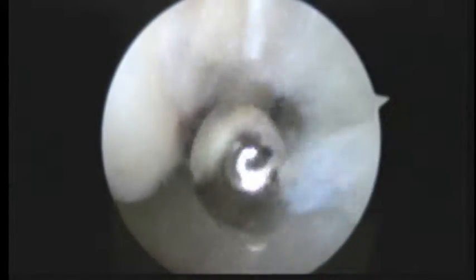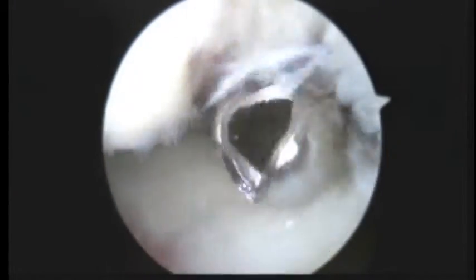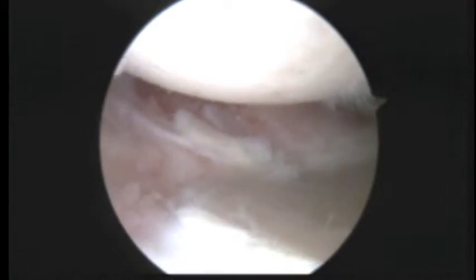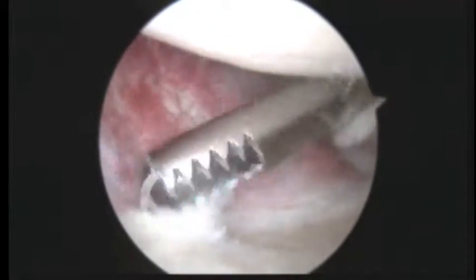The area of the rotator cuff tear is right here at the top of the screen. We can expose that a little bit more. You can see my shaver just disappears right through that hole there. I don't see much else inside the joint that we didn't expect, and what we were expecting was, again, the arthritis that we could tell from the studies. I don't see any loose pieces to worry about.